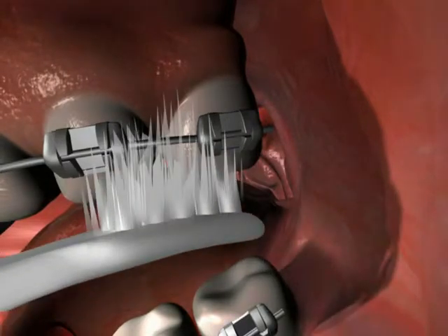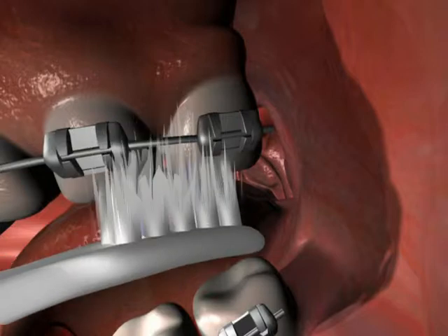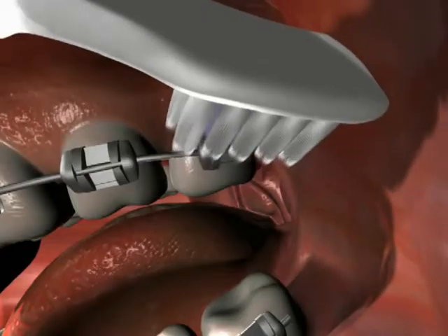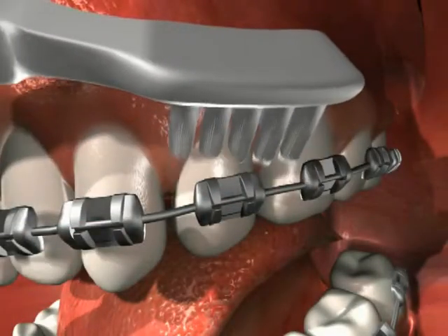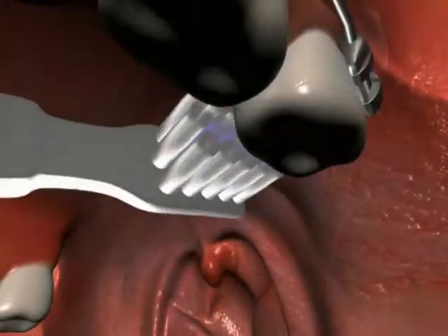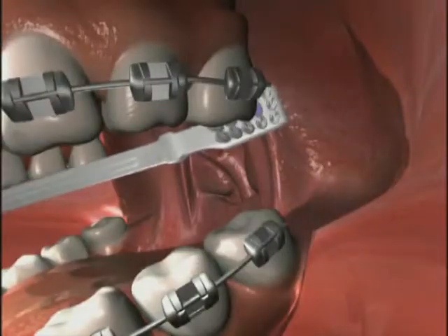Flex the toothbrush bristles to go underneath the wire and stroke away from the brackets, following the direction the tooth grows. Next, angle the toothbrush downward, and using the same circular motions, brush the top of the bracket, paying special attention to the area between the bracket and the gum. In this manner, carefully work your way all the way around the upper arch. Be sure to brush the back side of the rearmost teeth using the same circular motion.